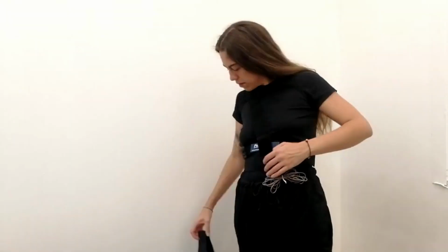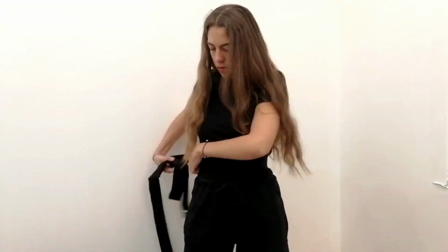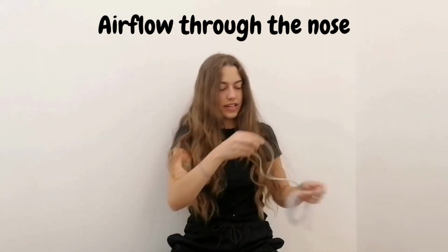These straps are electromechanical sensors, which means they work on stretch. As our chest expands and our diaphragm contracts, we can measure the signal. Finally, we use what is called a nasal cannula. And how this works is it monitors the air coming in through your nose and leaving through your nose.